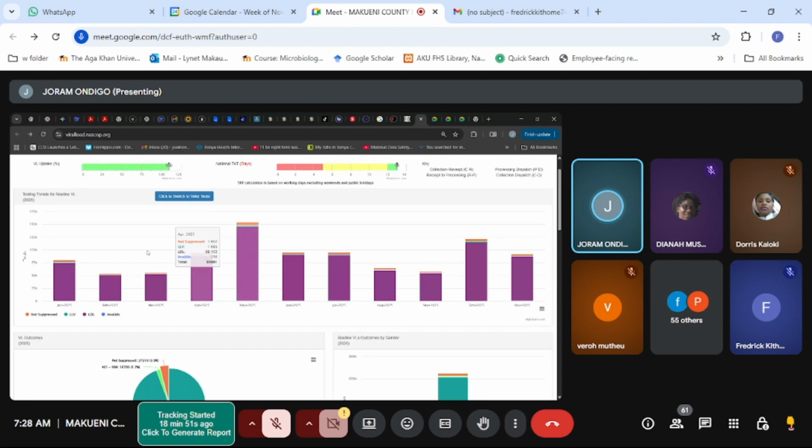154,169, of course. So that just tells you how the national is doing. Of course, you remember, during this period here is when we got the PPTs in the month of March. And then April took our samples, May. By this time here, results were coming, and then the PPTs you got went missing. Then we got PPTs in the month of September towards the end. And that's why you are seeing it's creeping up again.